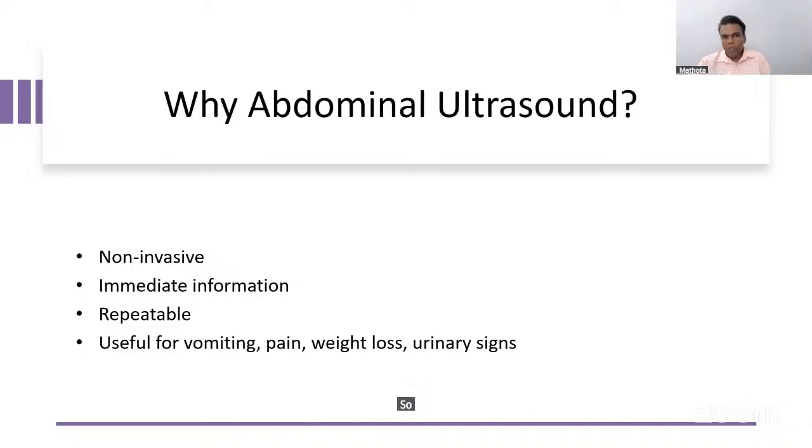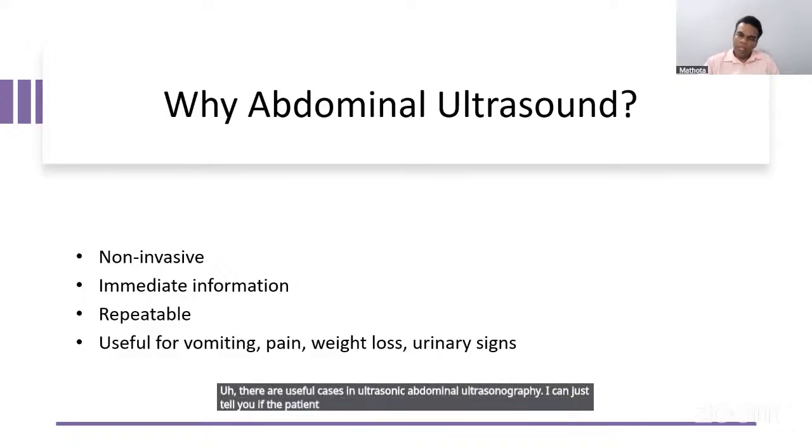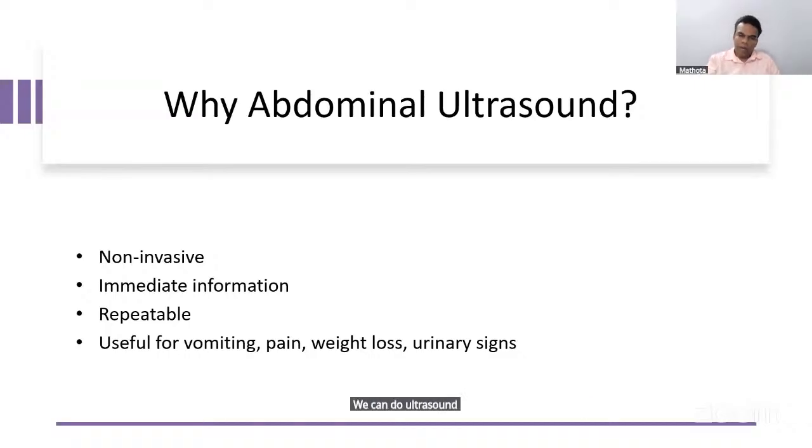So we can always repeat the examination. There are useful cases in abdominal ultrasonography. If the patient is vomiting, or if there's abdominal pain, sometimes weight loss, or any urinary signs, we can do an ultrasound scan.